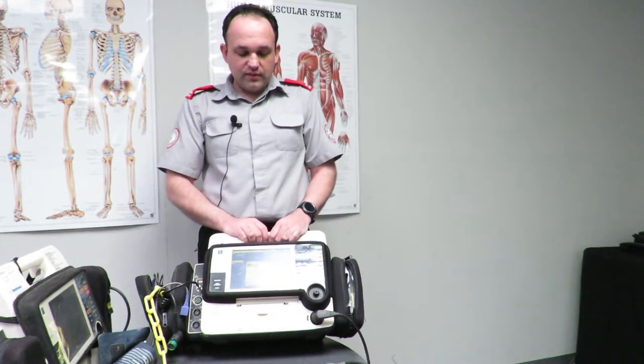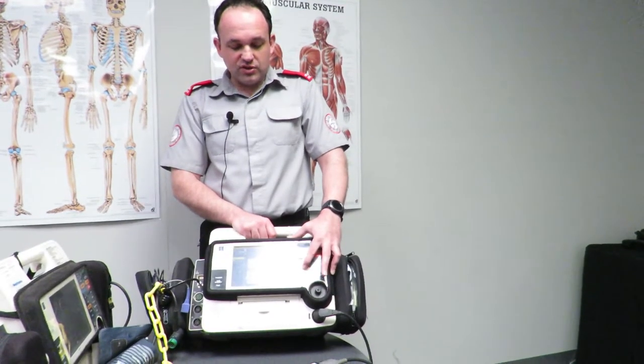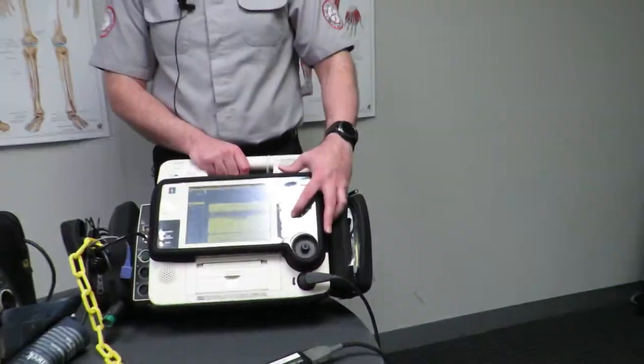You'll hear the alarm sounding. To turn it off, press the alarms button. Obviously you wouldn't do that during a real CPR case, but for the purpose of training and testing we can turn the alarm off.